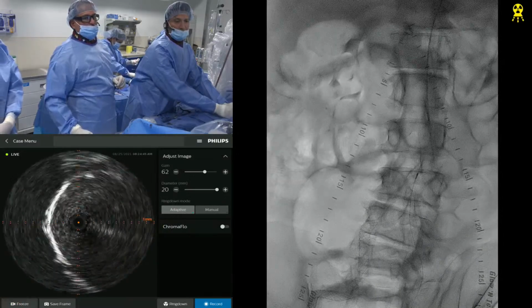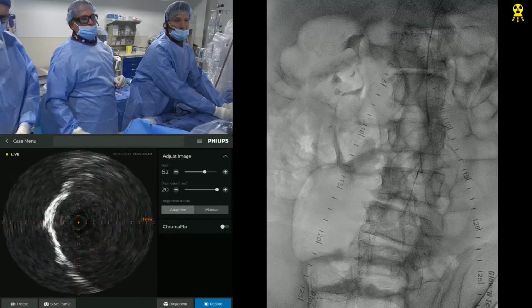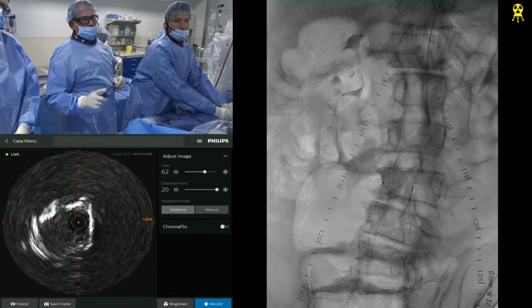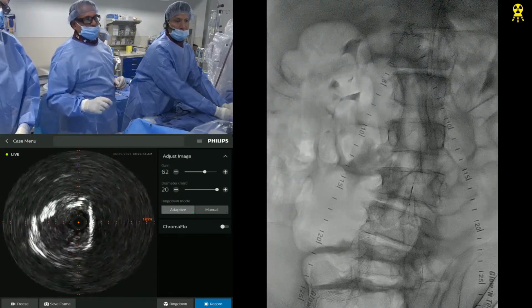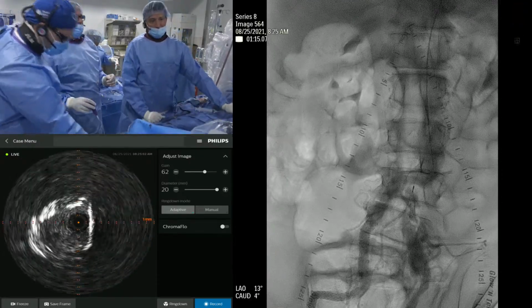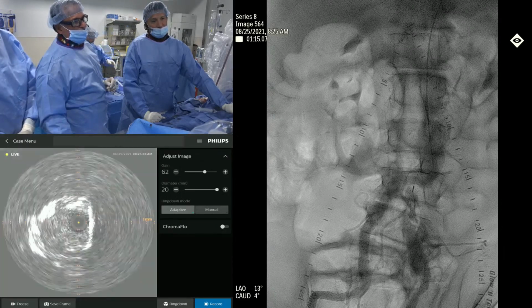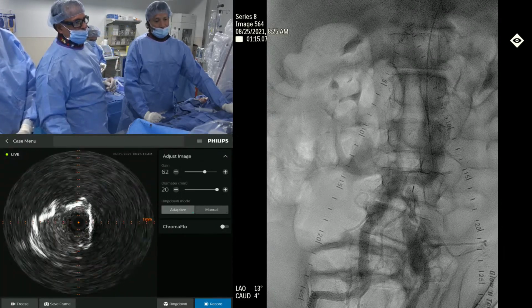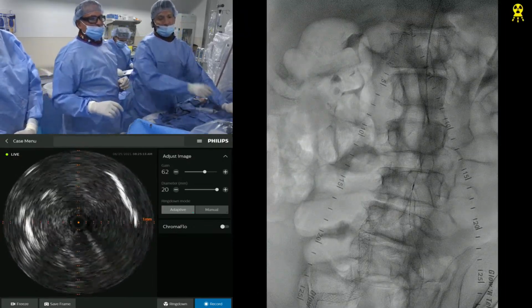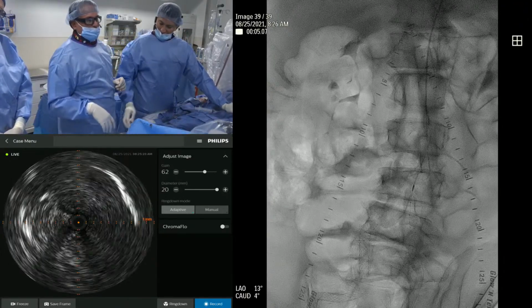Good job. Okay, now what I'm going to do is I'm going to inject, and we're going to do a fluoro save exactly on the spot. Walk it back. Okay. So see how IVUS is identifying the ostium, but it's definitely tight there. So fluoro save that. So that's the spot. So you can see now it's truly aortostial. We're likely going to pinch the contralateral side unless we balloon protect it. Or the question now is, do we just kiss? This is right at the ostium, right? That's right at the ostium. So you can see the IVUS really helps you to identify. So roadmap it.